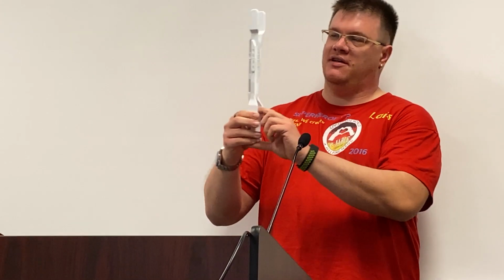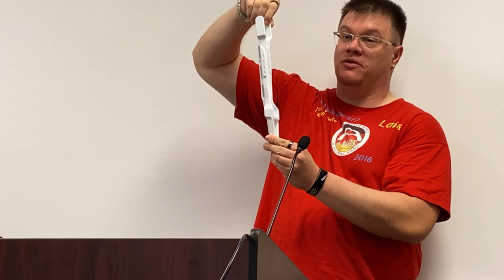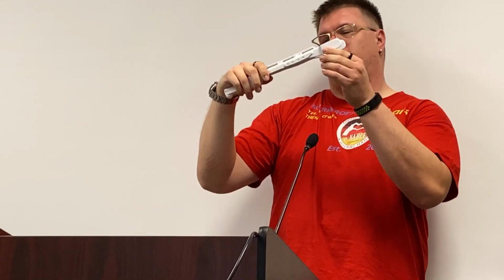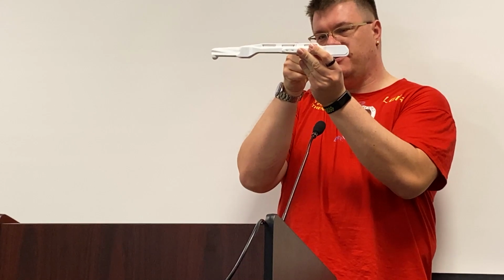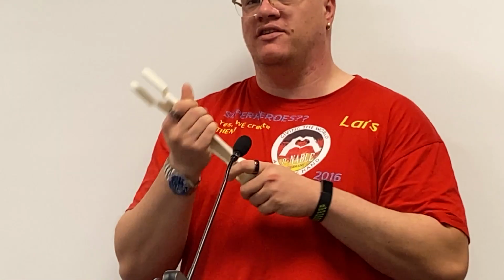And there comes the issue I didn't expect. For example, this is the lower leg of the bird, and then comes the upper leg. So it's a really big bird. But this part is all bone. And I had to connect it because my printer couldn't print it that well. So I had this little piece here and I have the pin. The first time it broke was here, and I was like, can't be, actually it's just one bone. So I reinforced it 3 times in different sections until I finally could make this version work. There's a fully printed version because it's really stronger.